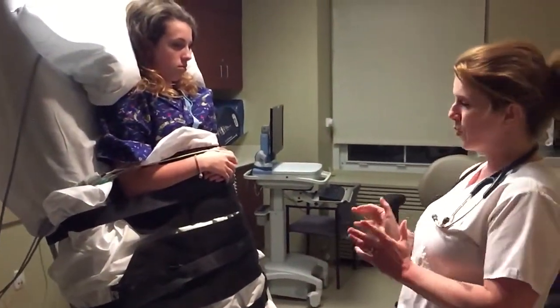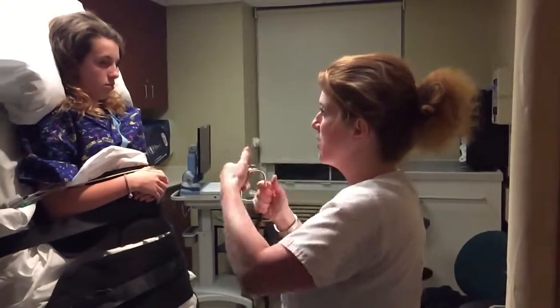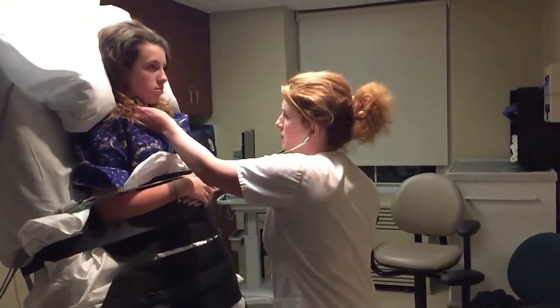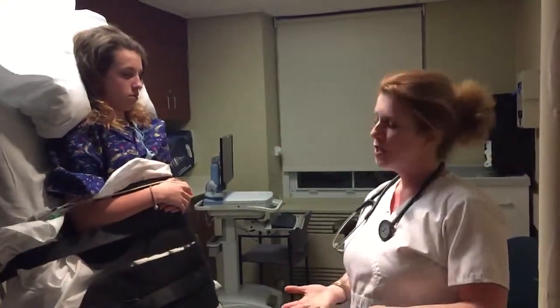If after 40 minutes there is still no syncopal episode, the doctor might take his or her stethoscope and listen to the carotid arteries for a bruit or obstruction. If he finds there's no bruit or obstruction, he might do what's called a carotid massage.